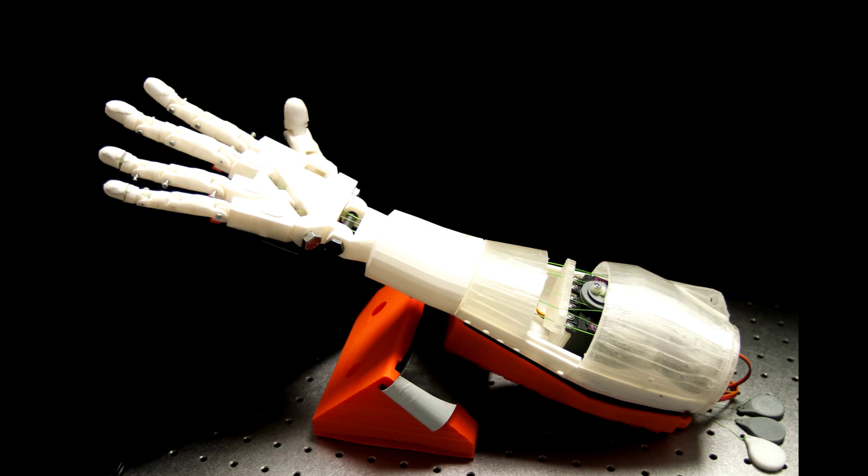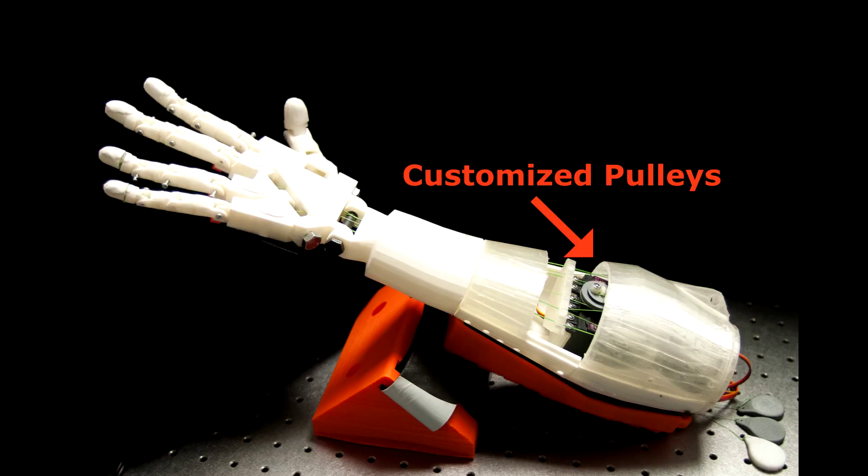In this project, we present a passive linear skin stretch device that can provide proprioceptive feedback when controlling multiple degrees of freedom in a prosthetic hand. We modified an open source 3D printed robot hand developed by InMove with custom pulleys that pull tendons moving both the fingers and contact pads adhered to the forearm. The pulleys and contact pads cost less than $2 in raw materials.